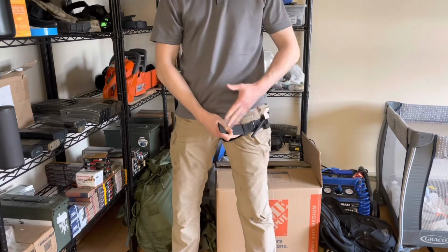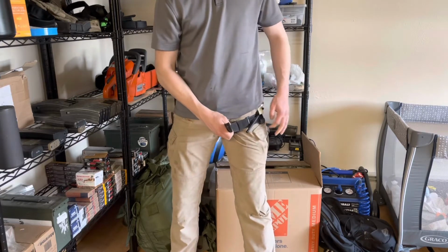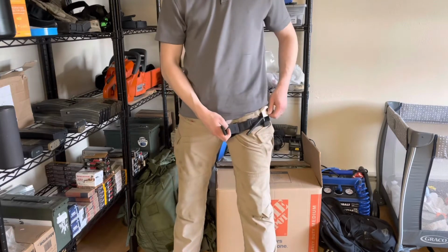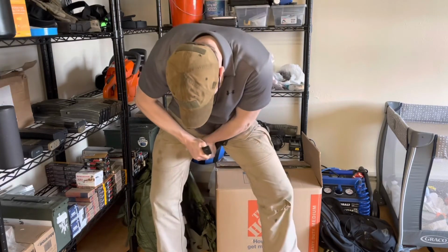Tourniquets hurt like a mother when you go to put them on, so be cognizant that it's going to hurt. If it doesn't hurt, you don't have an effective tourniquet. Unless you just have some kind of weird condition where you don't feel pain, it's gonna be unfortunate. So that being said, you're gonna get your initial tightening.